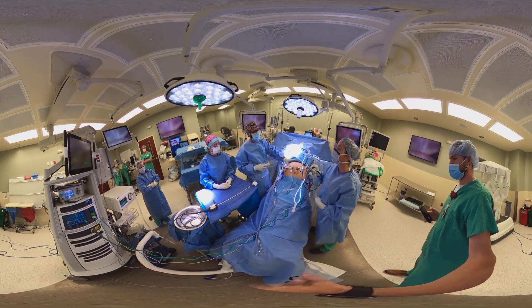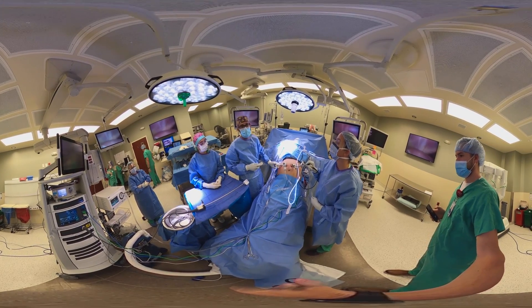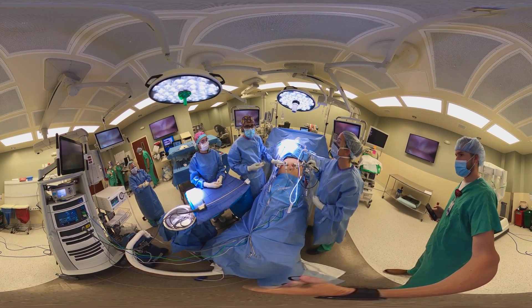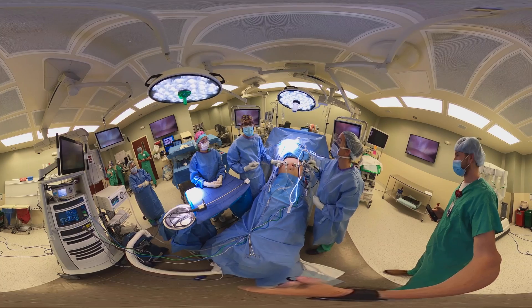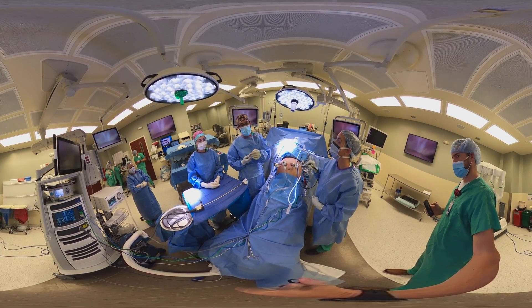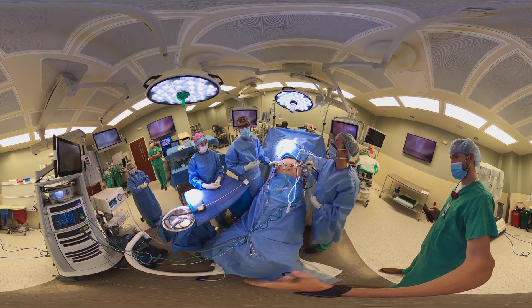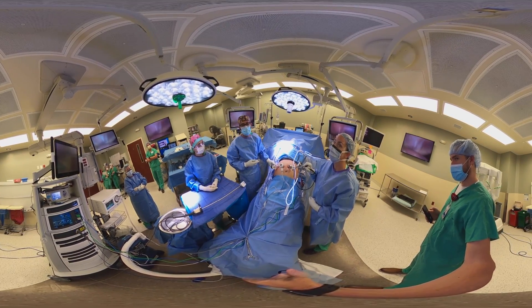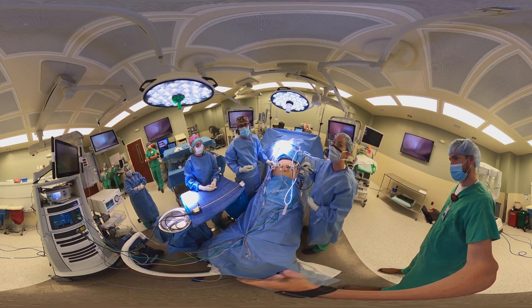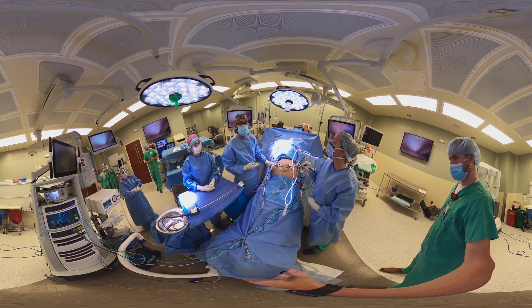Once the cannulas for the robotic instruments are in place and the abdomen has had the anesthesia block placed, the next thing that we do is obtain a core biopsy of the liver. We use an instrument that's about the width of a needle, and with this we take a small sample of liver tissue. We do that because we know there's a strong association between fatty liver disease, cirrhosis, and obesity, so this will help us diagnose that for future treatment.